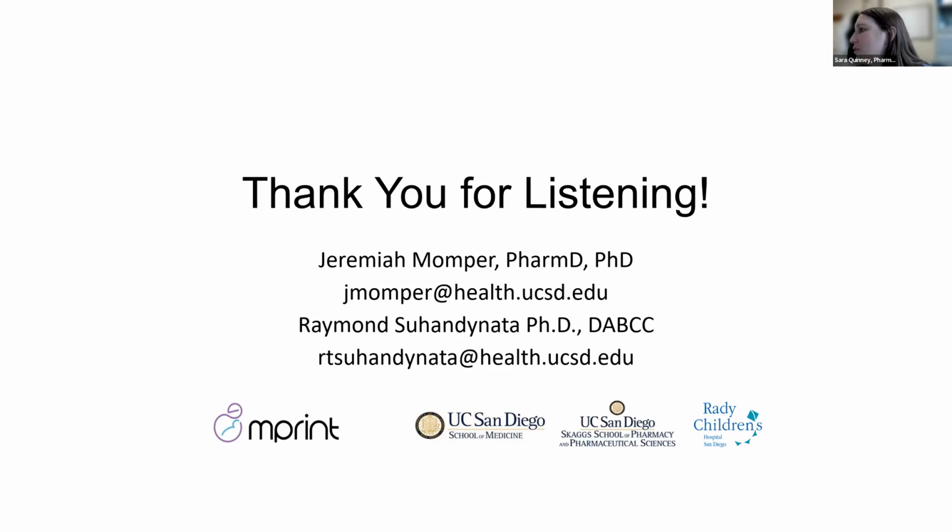Well, we are nearing the top of the hour. I do have one additional question. Sorry, I joined the webinar late. What was the 5% matrix enhancement that you were discussing? Oh, that was just an example. It's good to know how much matrix enhancement or suppression you have. I think we had to remove some of the slides that actually show the calculation. Typically, you'll do it with a blank to show that, well, in solvent, this is what I would actually see, but in, say, plasma, for instance, we get a 5% bias up, and we can attribute that to the matrix. I hope that clarifies that.